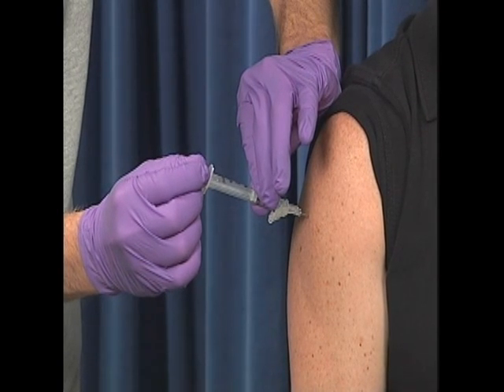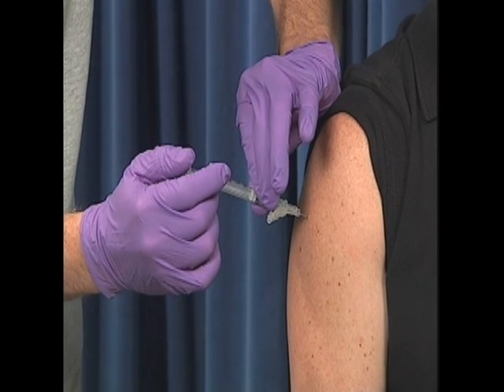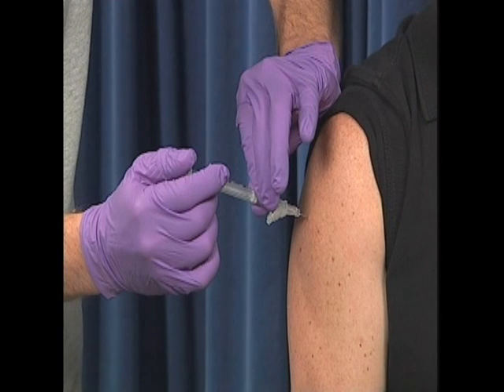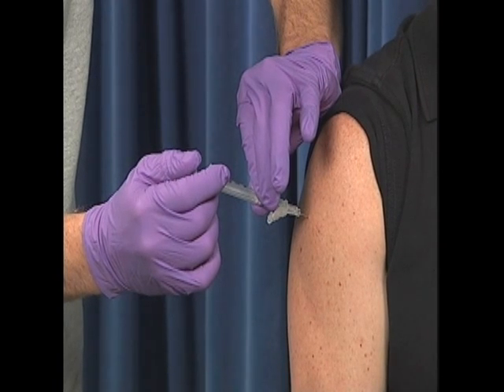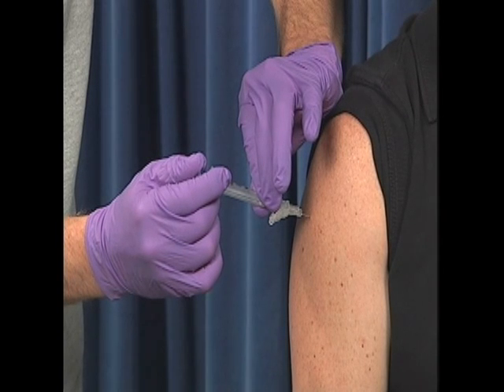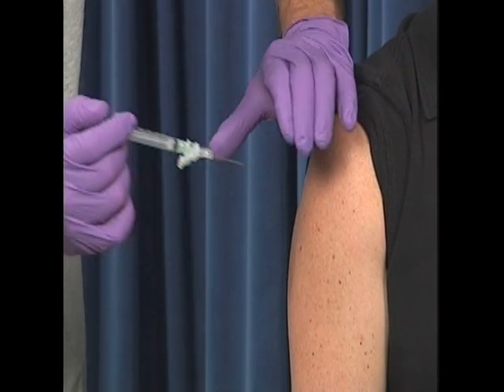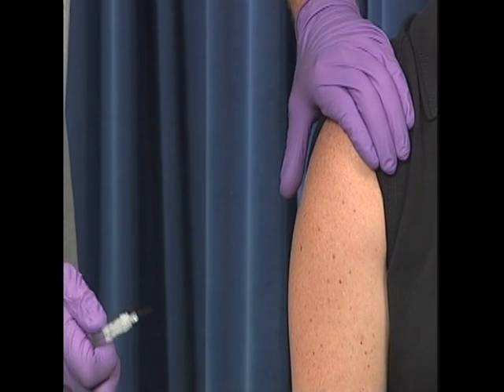Grasp the plunger and pull back to aspirate slightly and wait 5 seconds. If no blood aspirates into the syringe, proceed with the injection. Depress the plunger to administer the injection at a rate of about 10 seconds per milliliter. A slow, steady injection rate allows the muscle to distend gradually and accept the medication under minimal pressure.